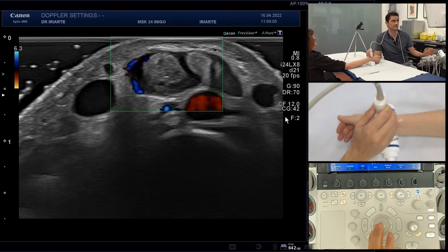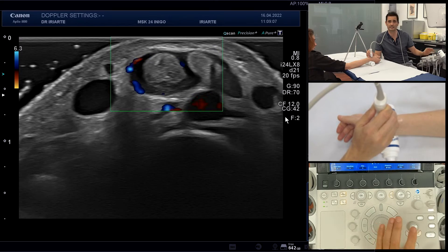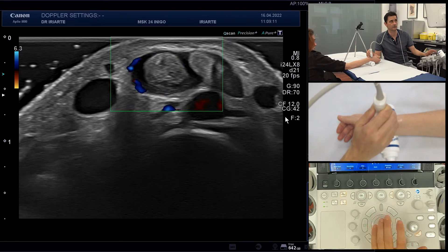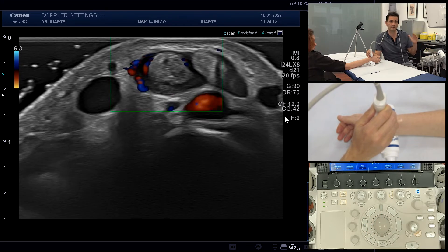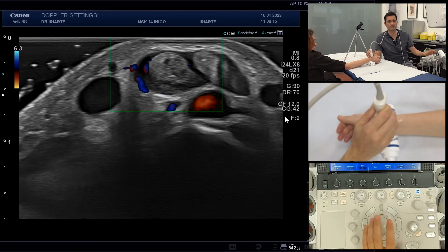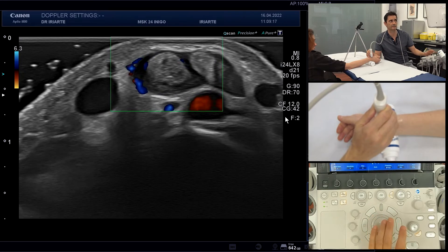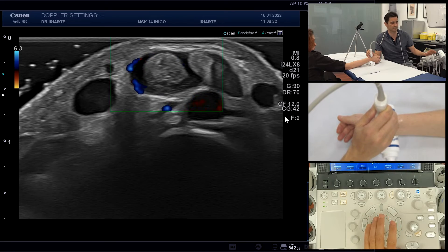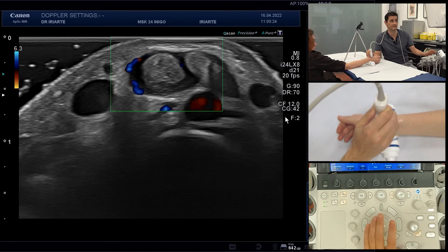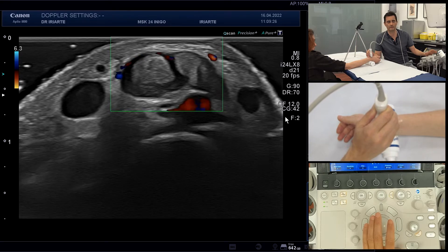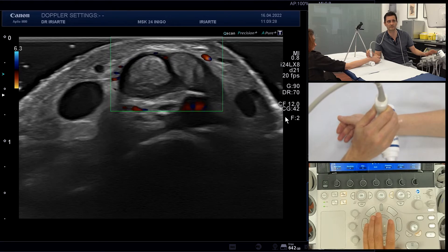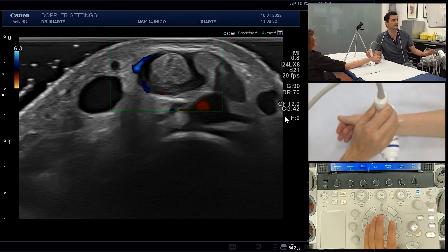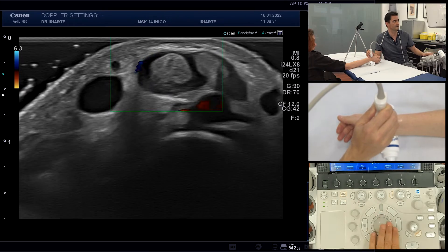There is a third parameter: frequency. Doppler also has a frequency and it works like B-mode. If you want to check very superficial vessels, you may need to increase the frequency. If you want to check vessels at depth, you may need to decrease it. Frequency in Doppler is not a very common parameter to adjust, but sometimes it can help.